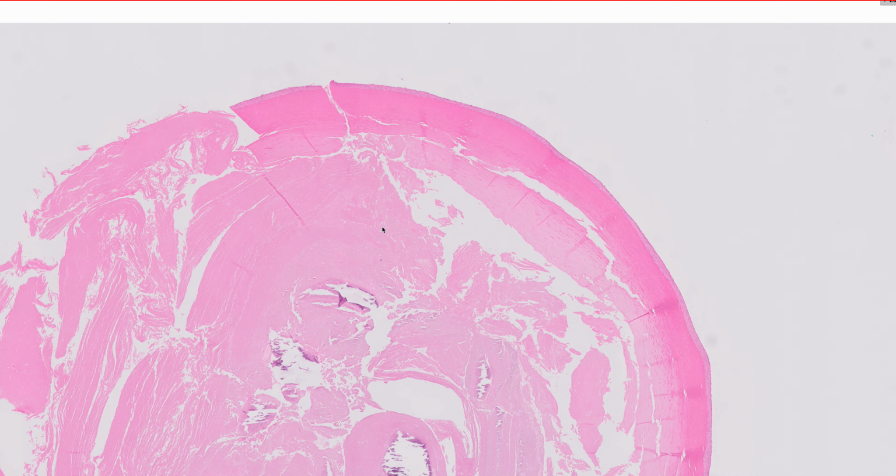And if we go a little bit closer, you can see one of the clues to this being a pilar cyst is the nature of the keratin filling the cyst, which typically forms this very thick, compacted mass of very brightly eosinophilic keratin. And here you can see it's calcified in areas, which is also very common.